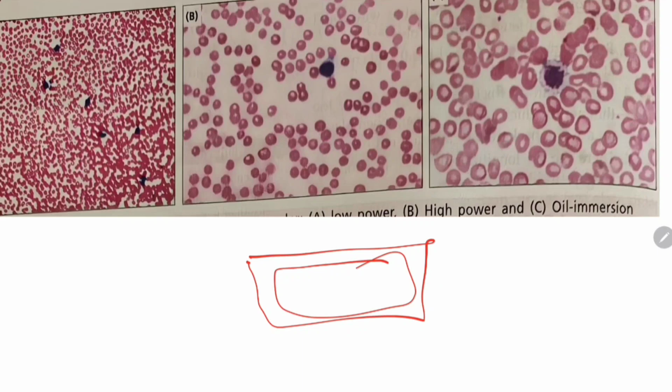Till now we have prepared the slide and stained it, and then after washing we have focused under the microscope. So if we focus on the low power, suppose 10x objective lens, the total magnification will be 100, 10x into 10x will be 100x. So your cell will look like this. These are actually white blood cells, WBCs, and others are actually RBCs. This red color is RBC.